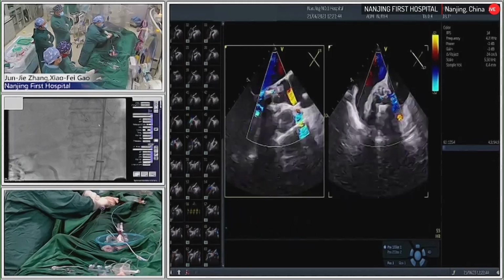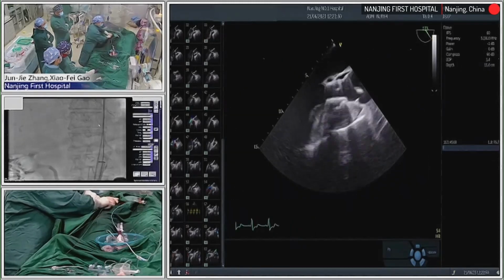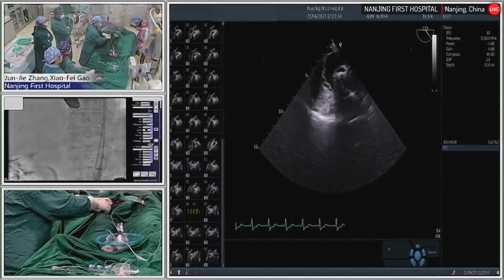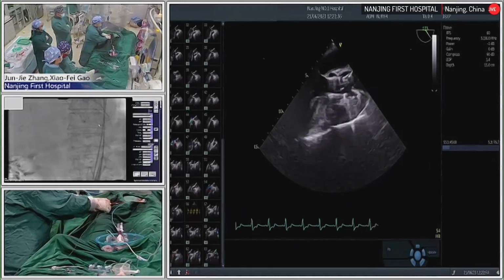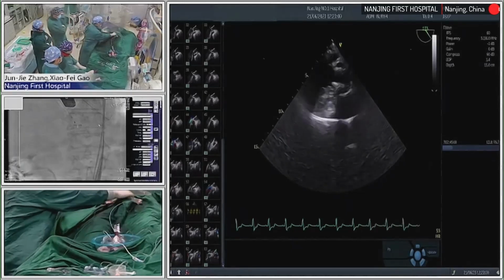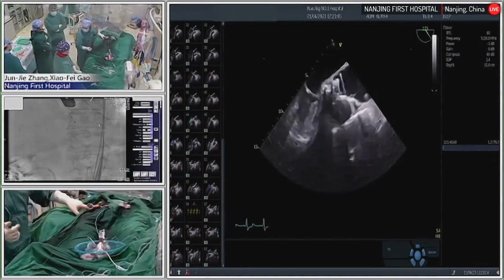Yeah, I think from my experience, it is a very perfect result for this patient. Okay, thank you for your introduction of the echo result. Thank you very much.